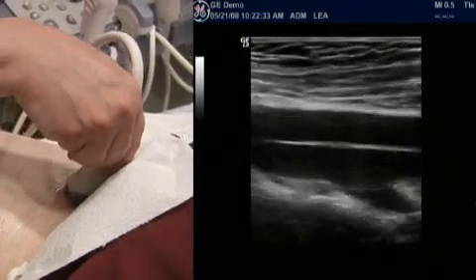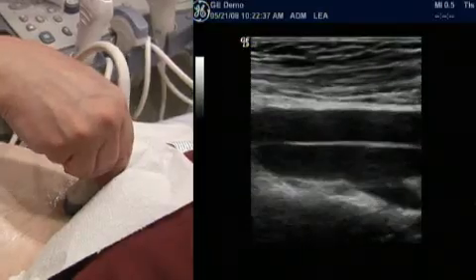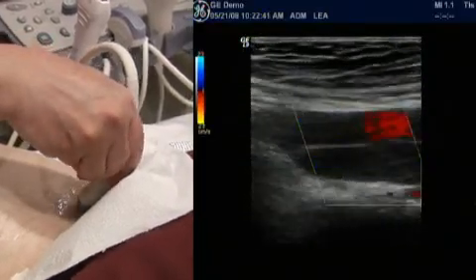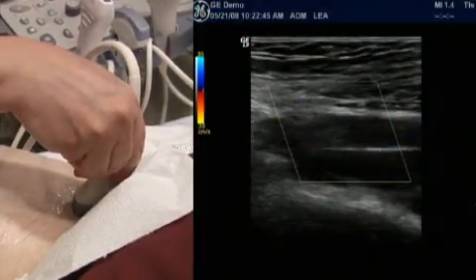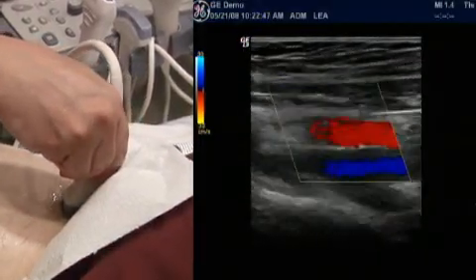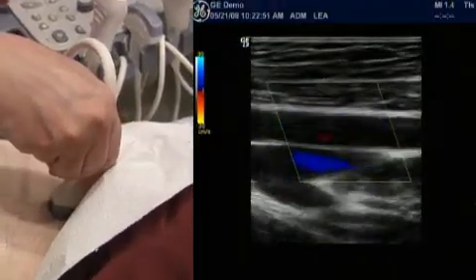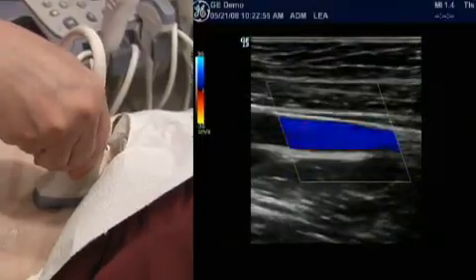So we know we're dealing with a very healthy blood vessel, and what we want to do is really Doppler through the entire length of the vessel. So whether that's in color first to give sort of an overall scan, or if we do it in triplex with Doppler, but I'm going to look first in color, because color certainly is a good tool.